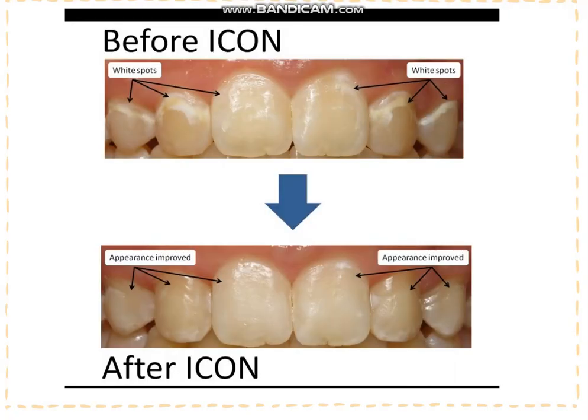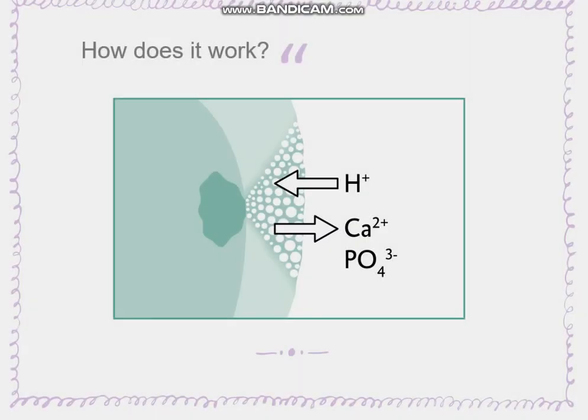As we can see, before the Icon, we have white spots appearing on the surface. And after the Icon, the appearance has improved and the white spots have disappeared.